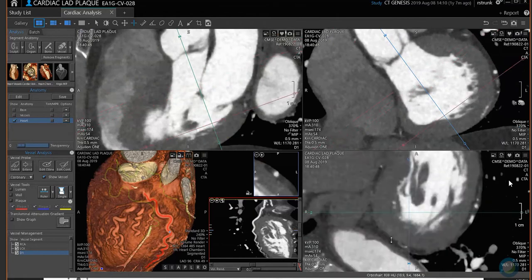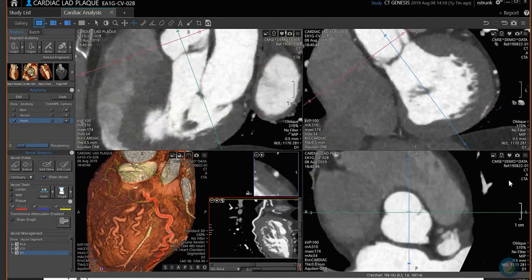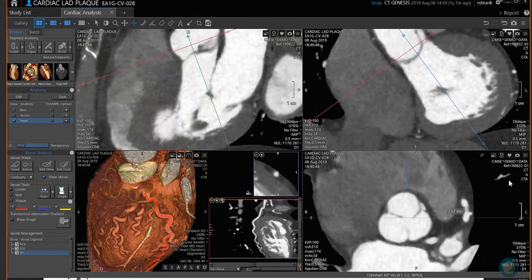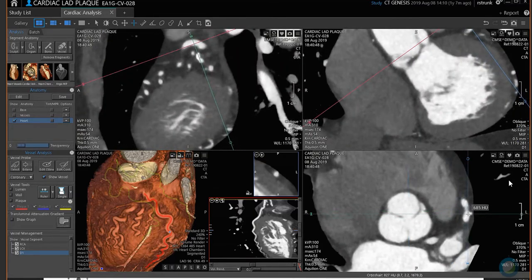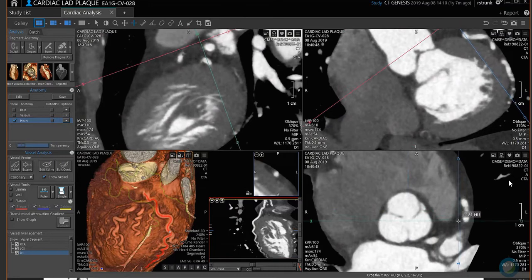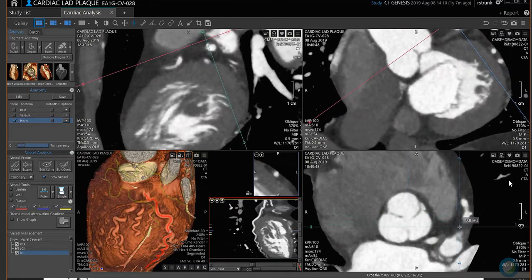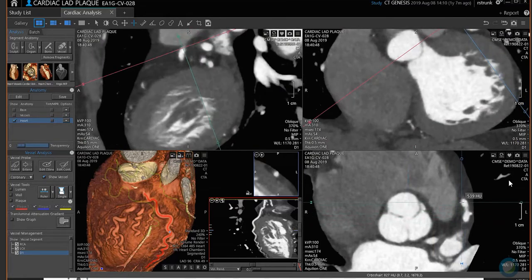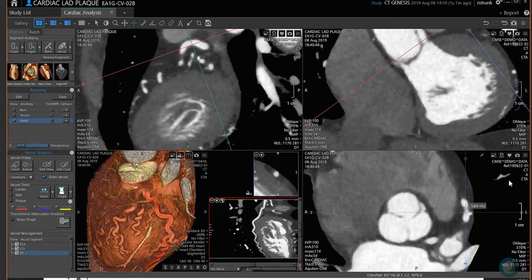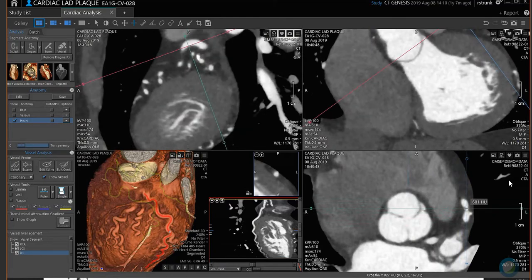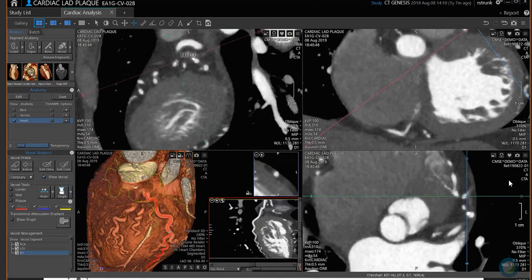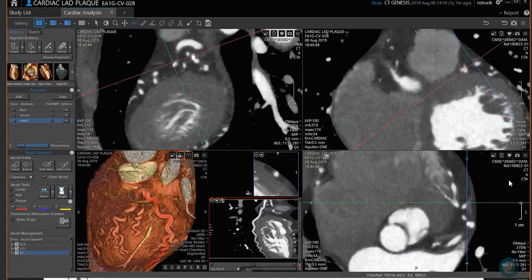If you are looking at a stent — this patient doesn't have one, but if I hold my crosshair down you'll see the Hounsfield units. Soft plaque measures about 60 or 70 Hounsfield units. You can also hold your left mouse down and go through a stent to see what the Hounsfield units are, since this is based on a single voxel where the crosshairs intersect. That's a good way to assess whether something is soft plaque or not.